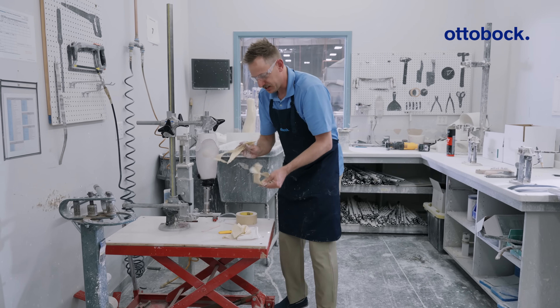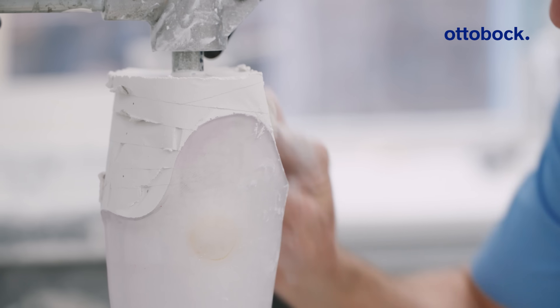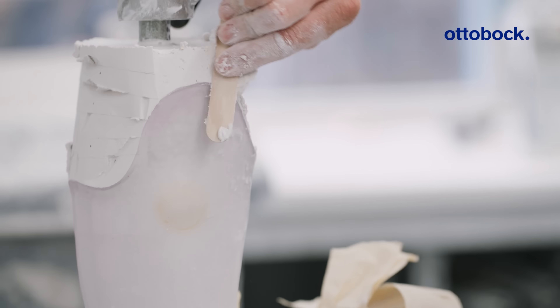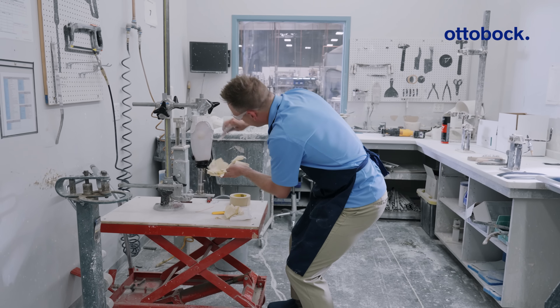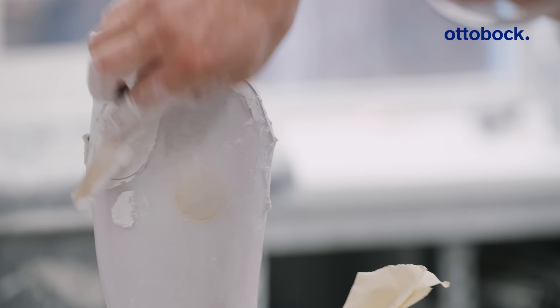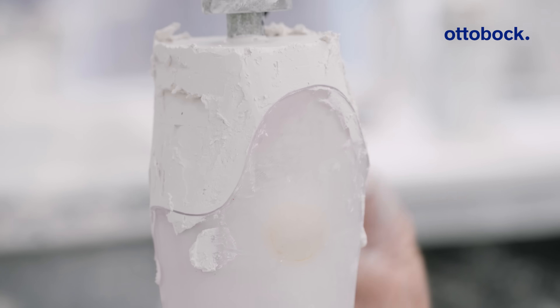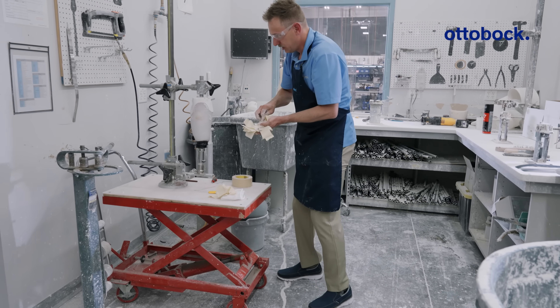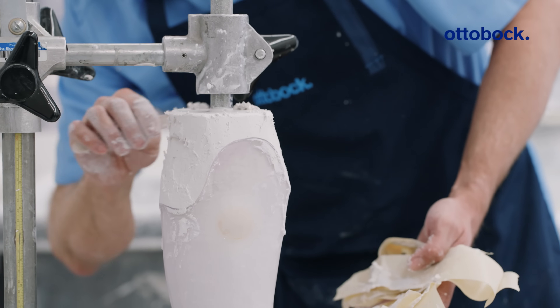I'll use this tape as a palette. I'm using a tongue depressor. While the plaster is still wet, I'll begin smoothing down around the edges of the trim line, carving any excess lips off and scraping it nice and clean. This is especially nice when you're transferring a transfemoral socket — you can pull some from the back and bring it around to the front if needed. And while you're at it, to save your PVA bag, come around the top and skim off that sharp edge.